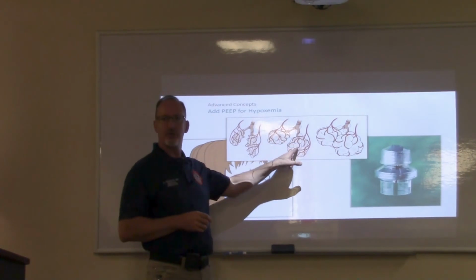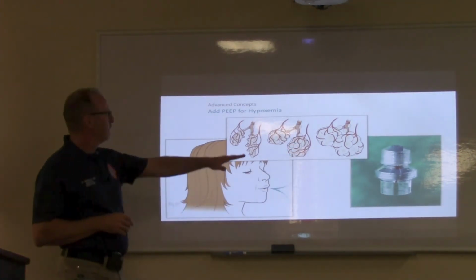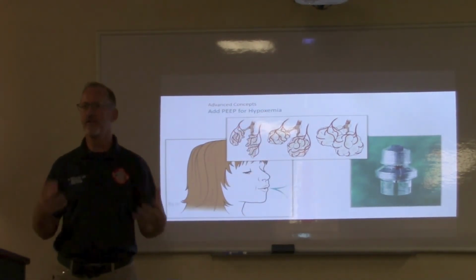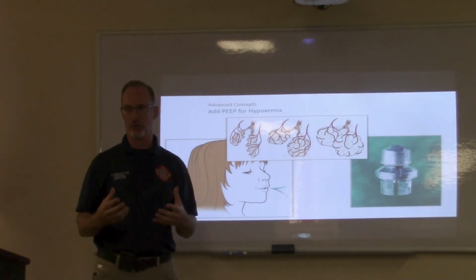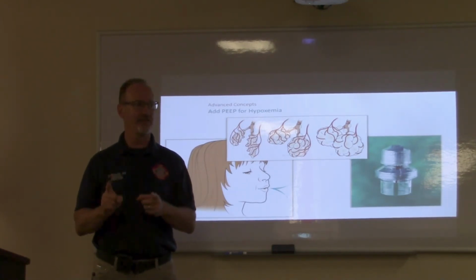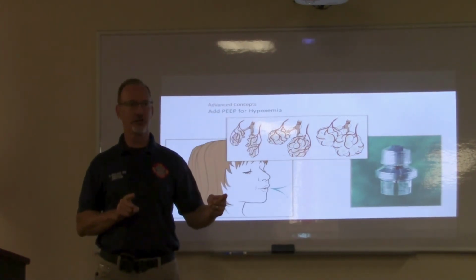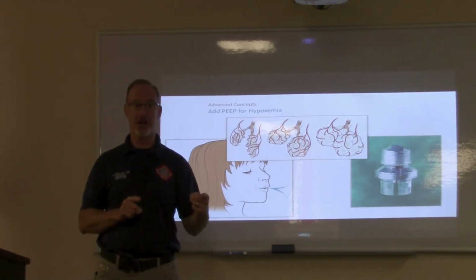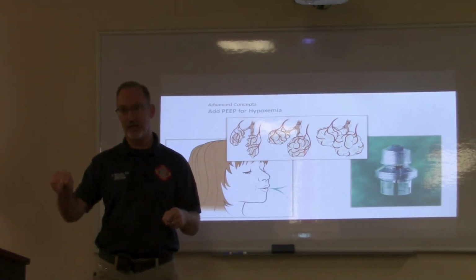Because that's where gas exchange is happening. So PEEP is phenomenal for hypoxia. If I have a patient who's on a ventilator and their SAT is low, I have only 2 things that I think of changing. I either change how much oxygen I'm giving them, and presumably, if their oxygen is low, they're probably already on 100%. But if they're not, I can change how much oxygen I give them.